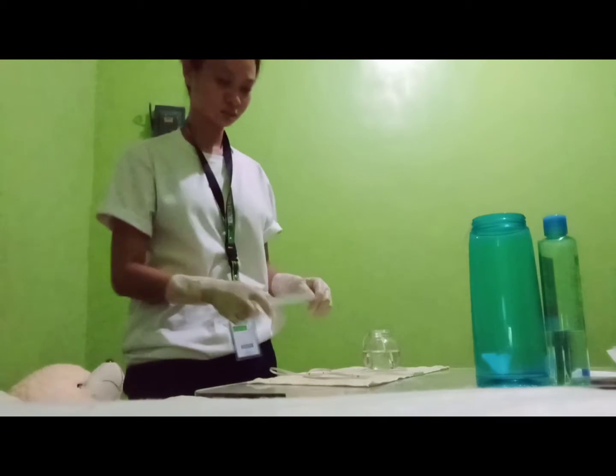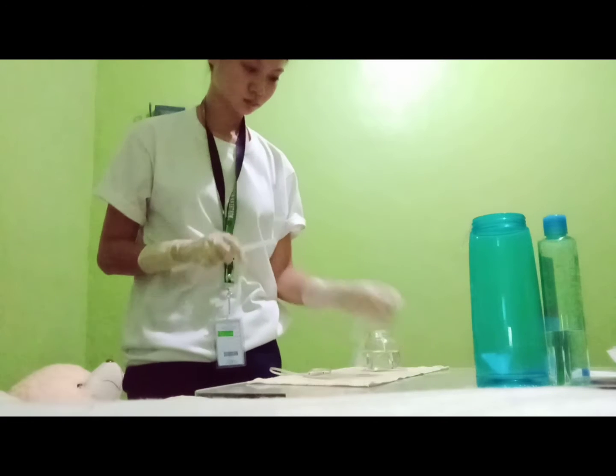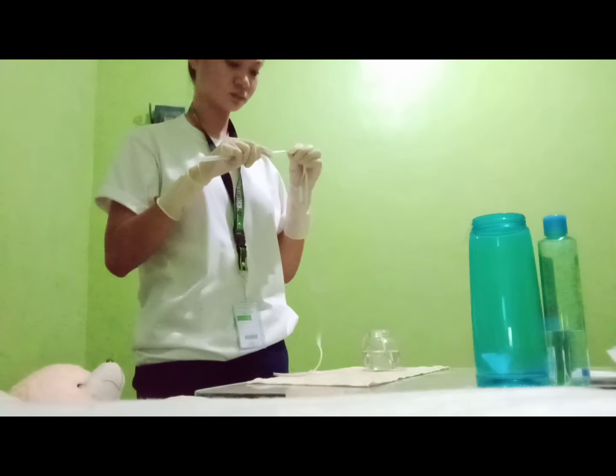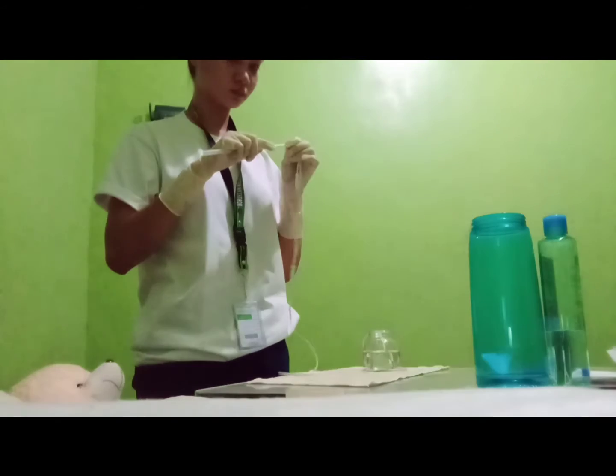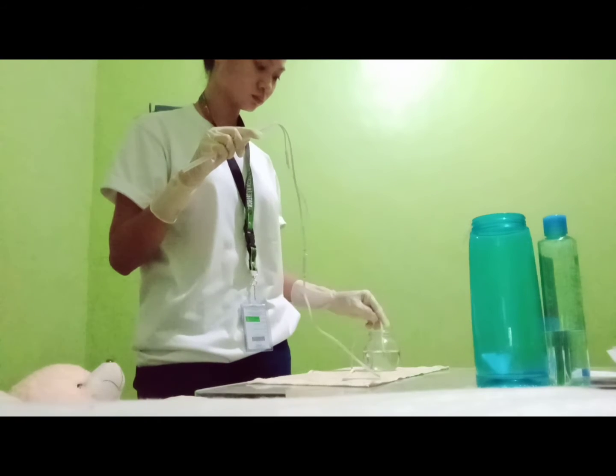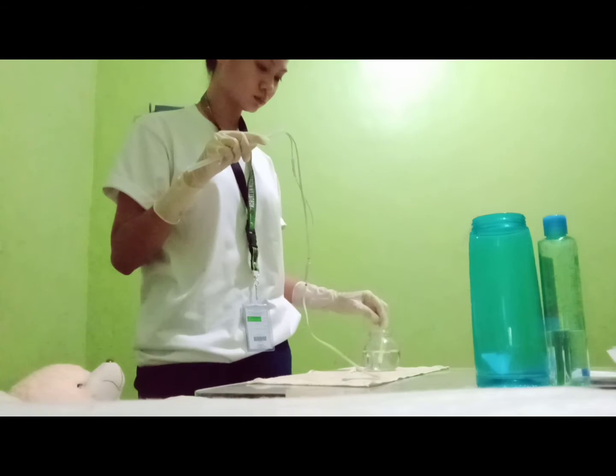Pick up catheter with dominant hand. Pick up connecting tubing with non-dominant hand. The non-dominant hand is now considered clean rather than sterile. Attach catheter to tubing without contaminating sterile hand. Place catheter end into cup of saline.